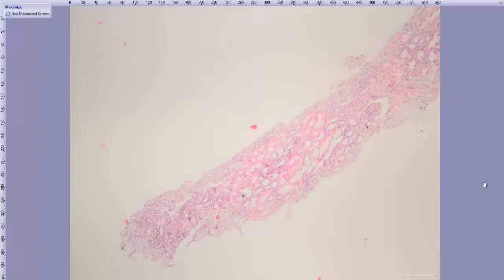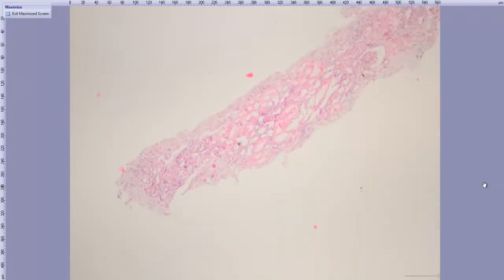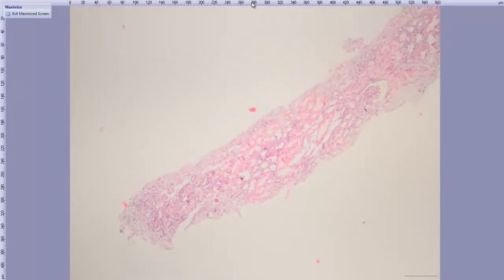In the emergency ward, all kinds of food intoxication, drugs, and other toxic agents he might have used or come across are ruled out. And he's hydrated, but despite hydration, his creatinine levels increased from 4.7 all the way up to 10 milligrams per deciliter, at which point they decide to take a renal biopsy. And this is the renal biopsy of the patient.